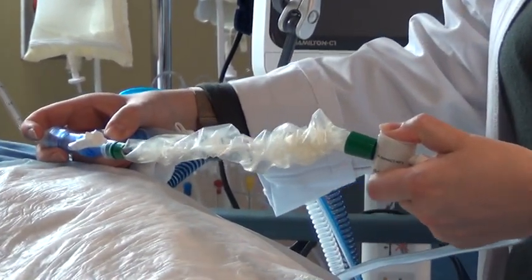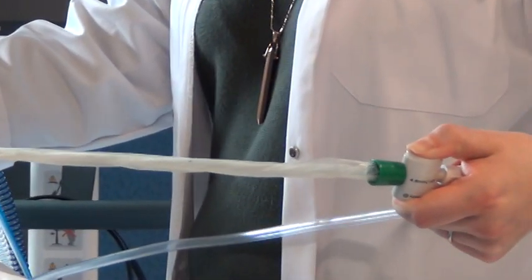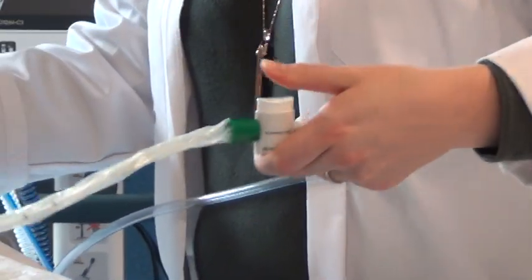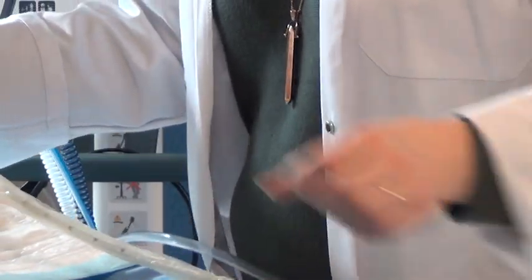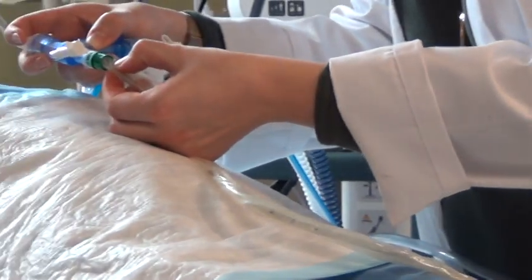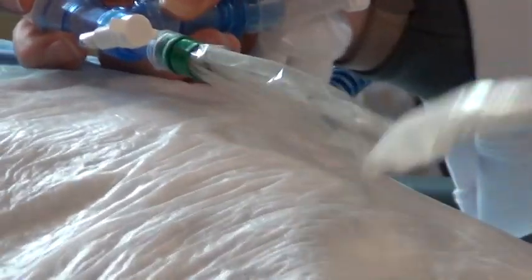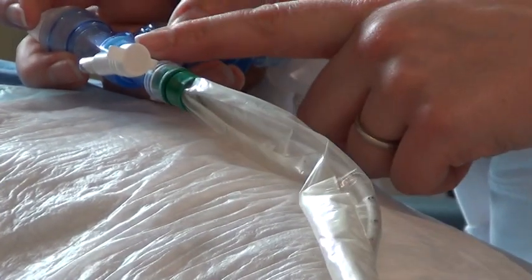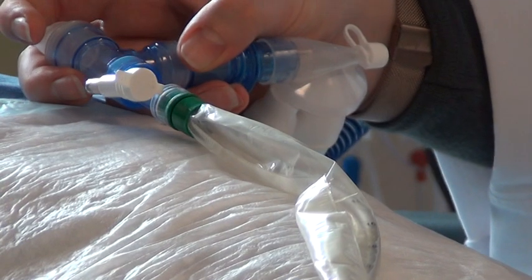And as we press, we pull. It's a continuous press. We do not want to press on and off. We really want to go continuously. We want to ensure we're pulled all the way out so that we see this big black mark that was there. We want to make sure that we can see this so that we know that we're correctly out of the lungs and there's no suction catheter that's blocking any of the air going into our patient.